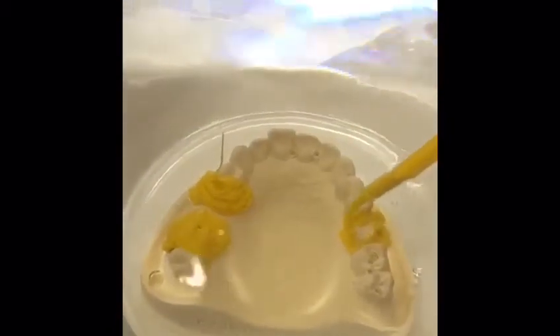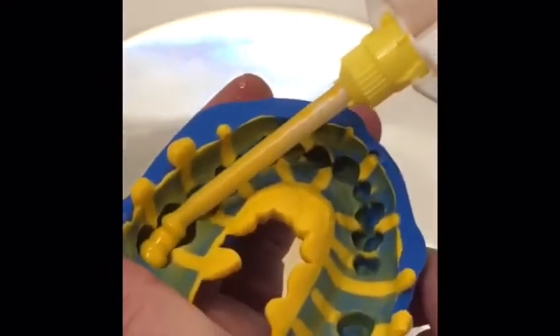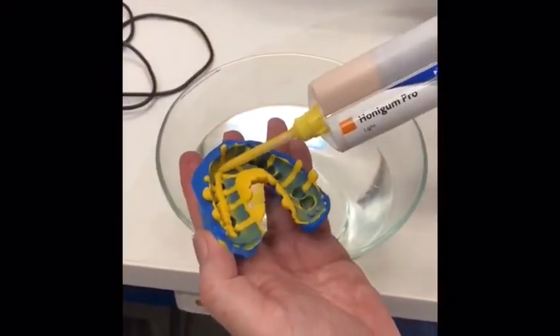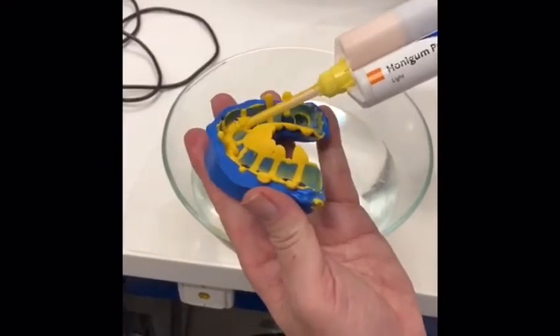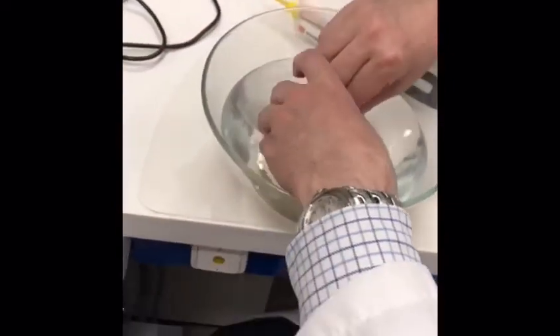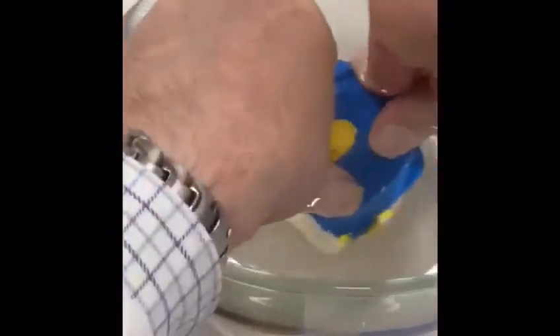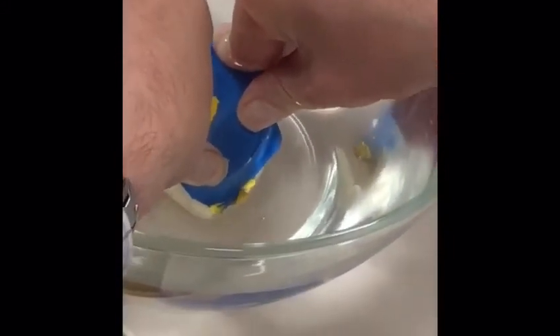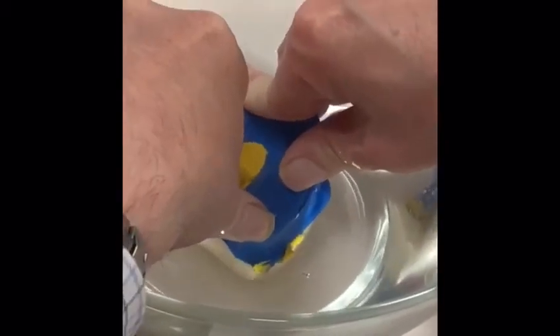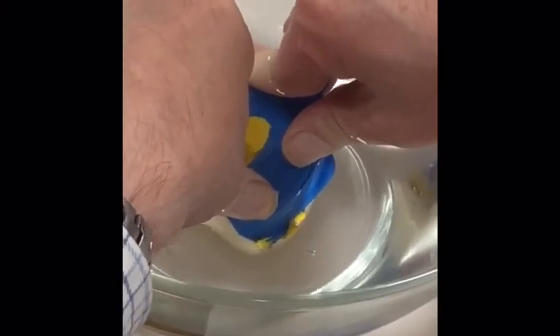Just going to cover everything here, remove the tip, and put quite a generous amount of light body into the pre-impression, then reseat that on the model. I have to be careful that I'm really reseating this — put a bit of pressure on there and keep it in place.